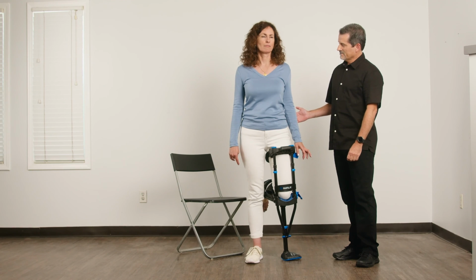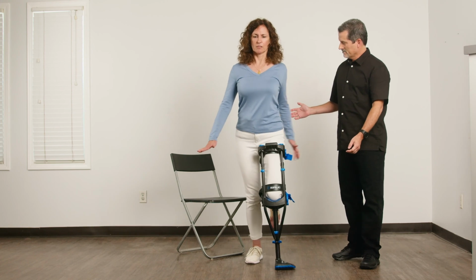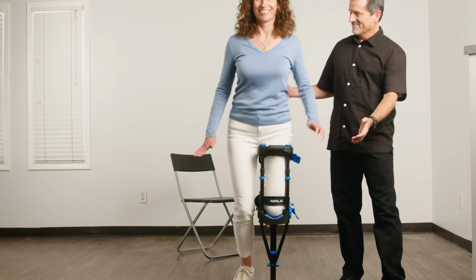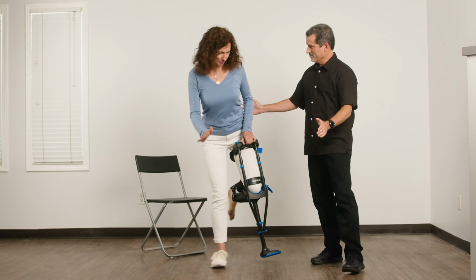If at any point in the training process the patient is really struggling and wants to stop or give up, it's best if you don't force them to continue. Often, just taking a few minutes for them to regroup and regain their composure is enough. But you also need to realize that sometimes, even people who meet all the physical qualifications simply cannot adapt.